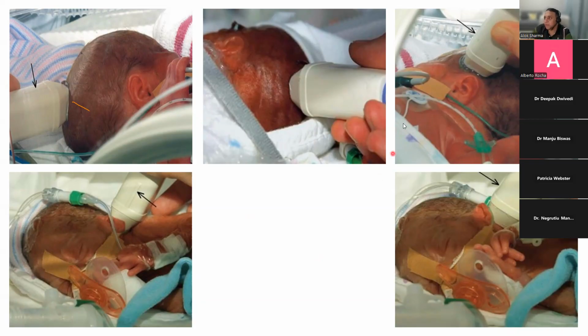But holding the probe like that is the worst way to do it. Your actions will be wide, the baby moves, your probe will be all over the place. It will easily slip off the fontanelle and go onto bone because you're looking at the screen and trying to hand-eye coordinate. So have a look at me again.